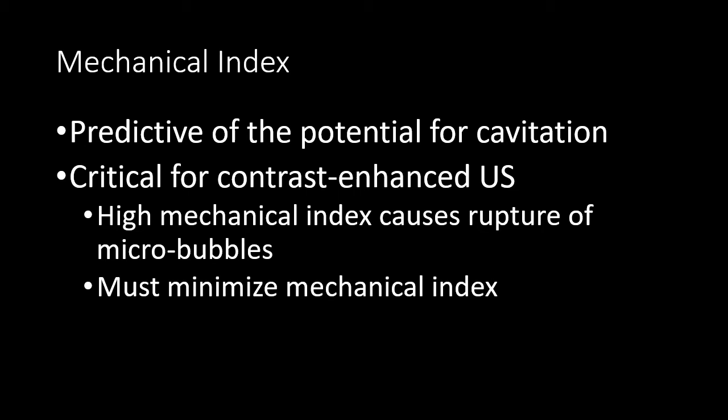The mechanical energy that is being transmitted in an ultrasound wave, as it compresses and causes rarefaction of the tissue, there is a potential for injury to that tissue. And the injury that would occur would be due to cavitation from that mechanical energy passing through the tissue.